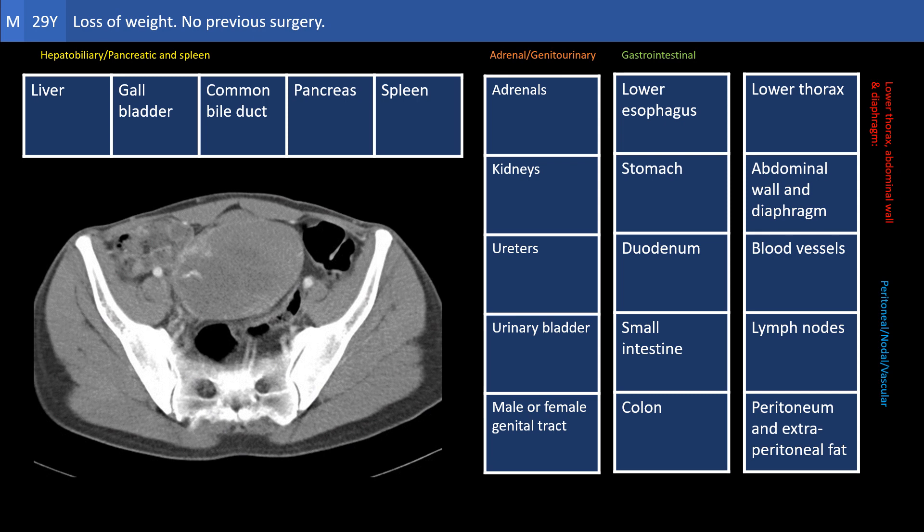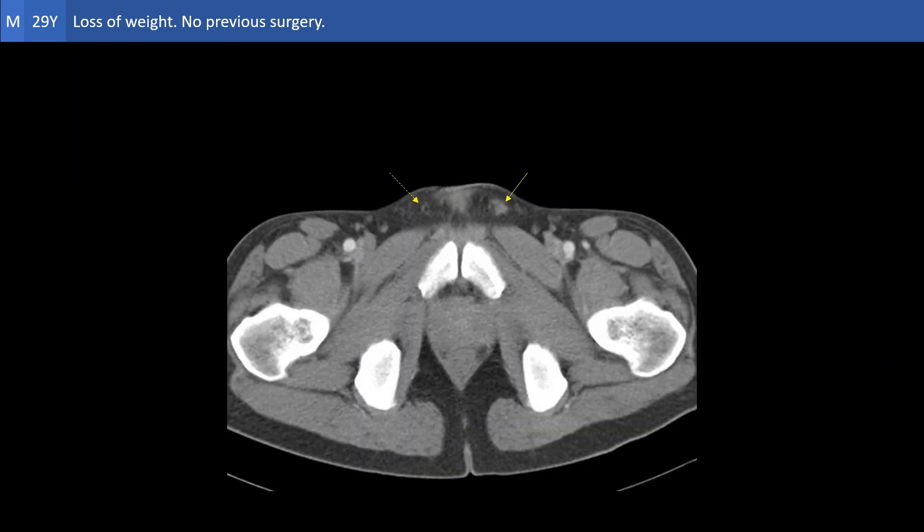It should not be a guess. It should be based on a radiological finding. Or have we missed the finding during our initial scrolling?